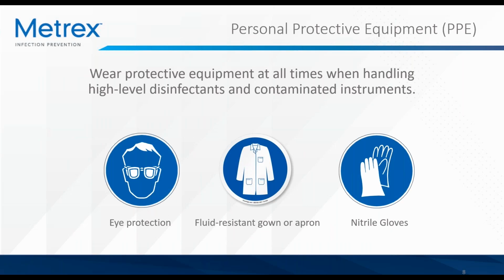Part of the product training and education you need as a healthcare professional is knowing what PPE, or personal protective equipment, should be used while handling the product. You should wear protective equipment at all times when handling high-level disinfectants and contaminated instruments. Be sure to don your PPE prior to handling MetriCide OPA+.